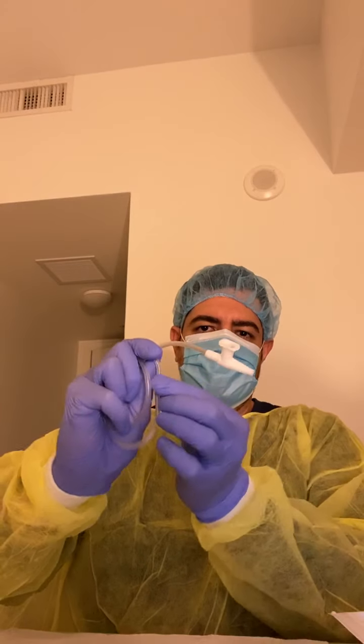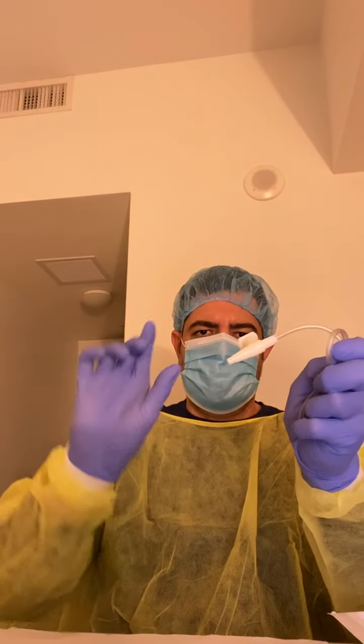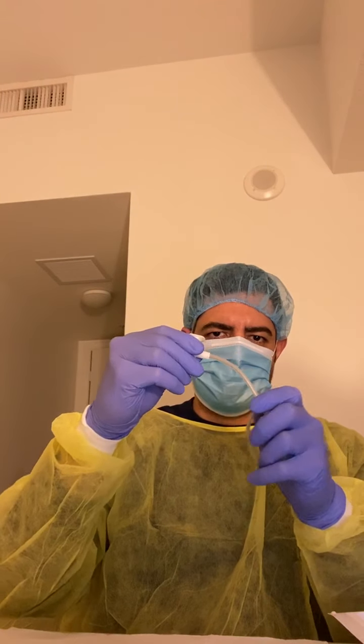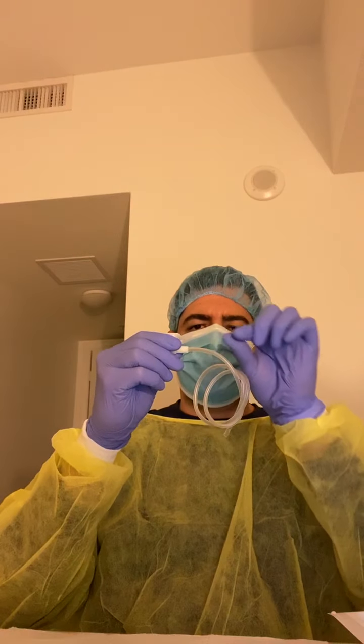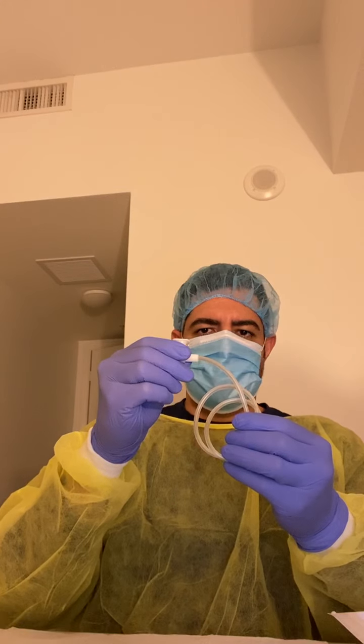This is what I'm going to have to use as an inner cannula. I don't have anything that resembles it. We're going to pretend that it ends right here. So this is my dirty hand. This is where I can actually touch the white part of it. Always keeping it by your side. The curvature has to be like you see it right here, and then we're going to place it in the normal saline, in this part.